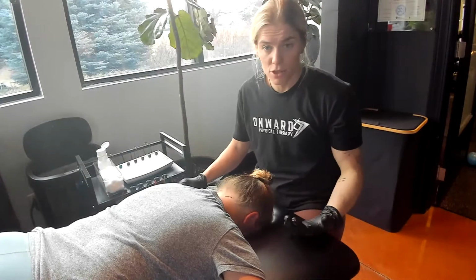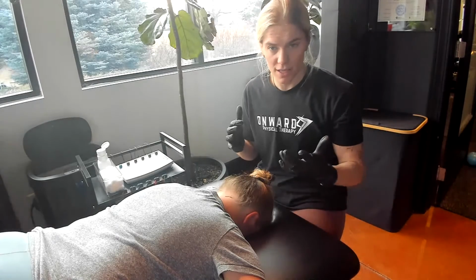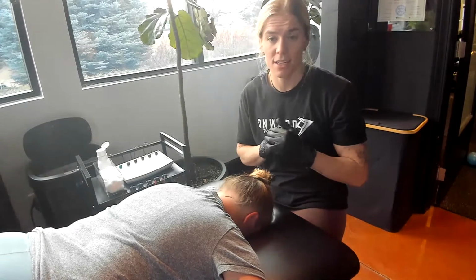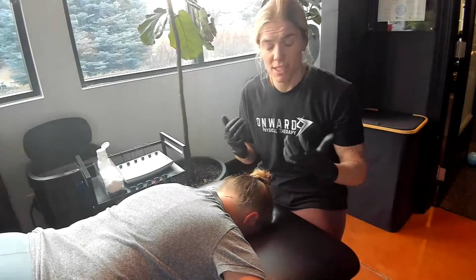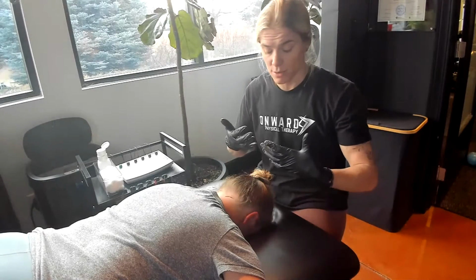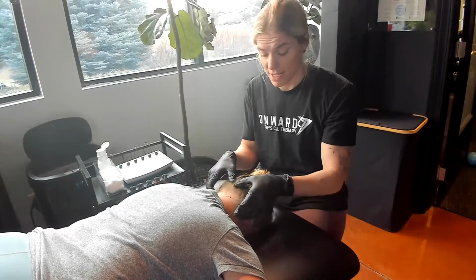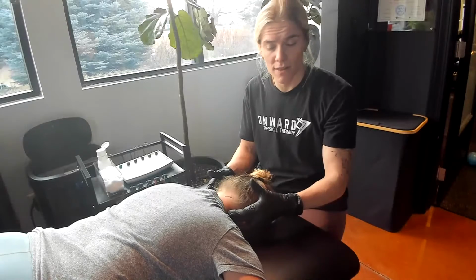So again, optimal treatment for these muscles is going to be setting up a circuit for pain modulation and treating that tissue there. We want to limit pistoning in order to mitigate interaction with some more sensitive structures, including the greater occipital nerve. Again, for these suboccipital headaches, we are not treating the true suboccipitals. We are a little bit more proximal to that. We are thinking we are at the occipital insertion of upper trap and semispinalis. We want to orient ourselves to this anatomy by finding the EOP, mastoid process, and the region of the true suboccipitals as to avoid that area.